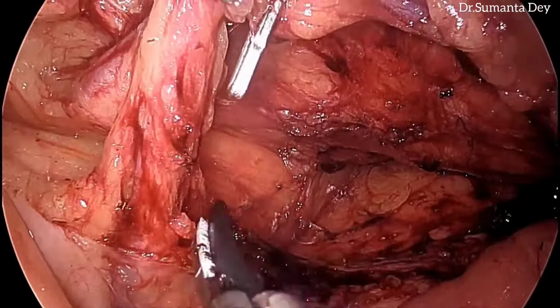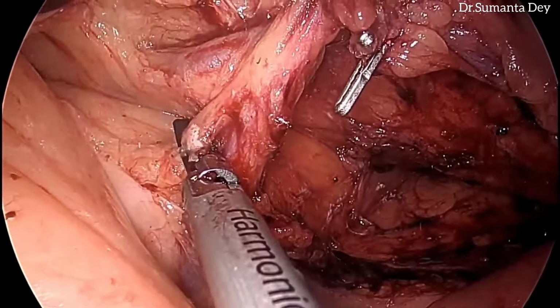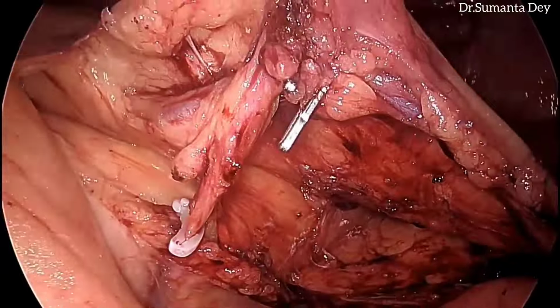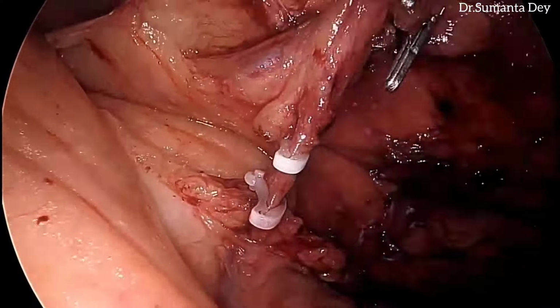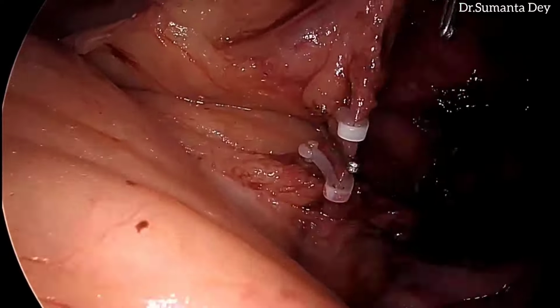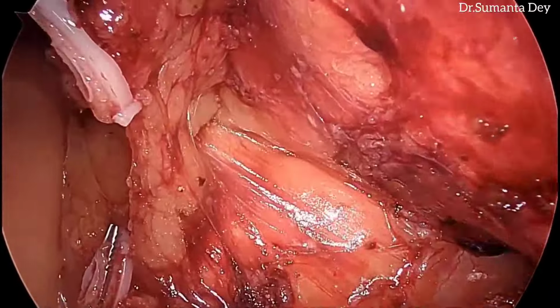We'll divide the perivenous fibrofatty tissue. The inferior mesenteric vein will be ligated just distal to the root, 1 to 2 centimeters distal to the root. It is being ligated with Hem-o-lok clips, 2 Hem-o-lok clips, proximal and distal, and 1 Liga clip towards the proximal side here. Now we can divide the vein in between. Once we divide the vein, we can proceed further with the dissection.